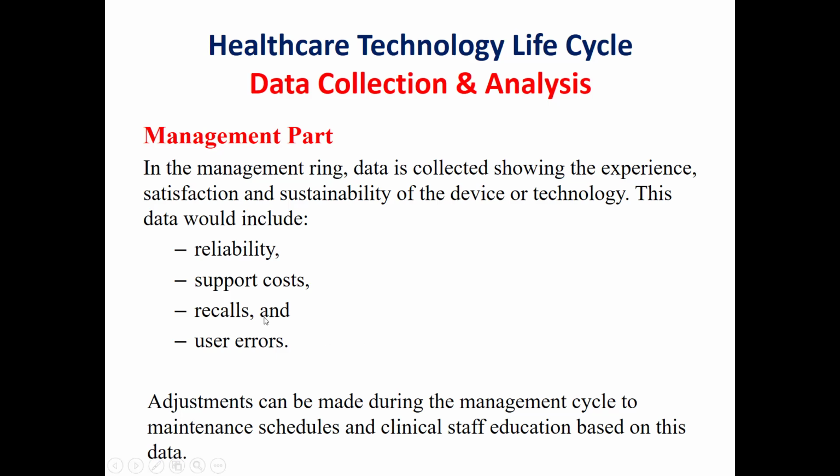Also, another important point about which we can collect information and data is the user errors. In case we have a large number of errors, we should take an action, which is either the retraining of the staff in the proper use of this medical device, or maybe some modification or the removal of the device itself in case we cannot improve the situation.